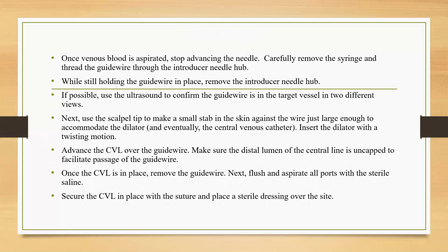Once the central venous line is in place, remove the guide wire. Next, flush and aspirate all ports with sterile saline. Secure the line in place with a suture and place sterile dressing over the site.